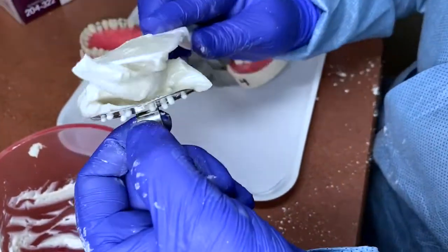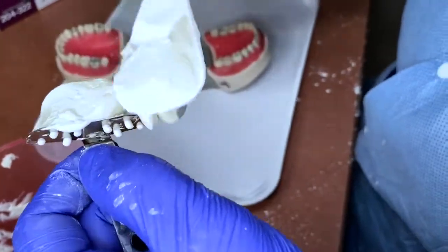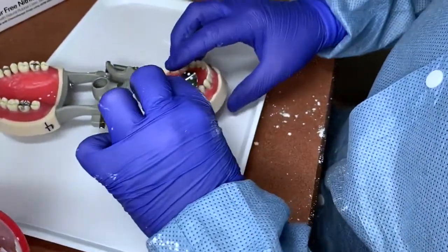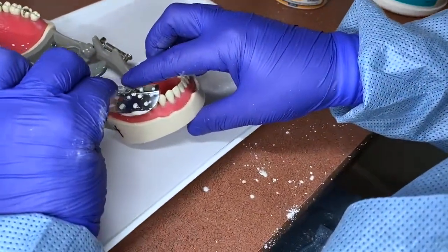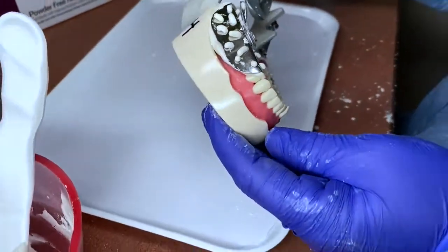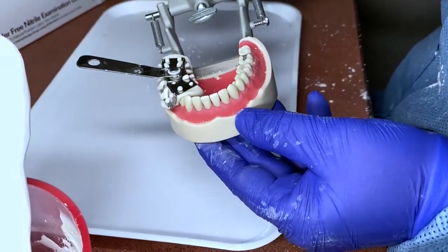You don't need to overfill the tray since the tooth isn't prepped yet — it'll squeeze out. Load it in the tray and place it over the teeth you're taking the impression of, which is number 31.